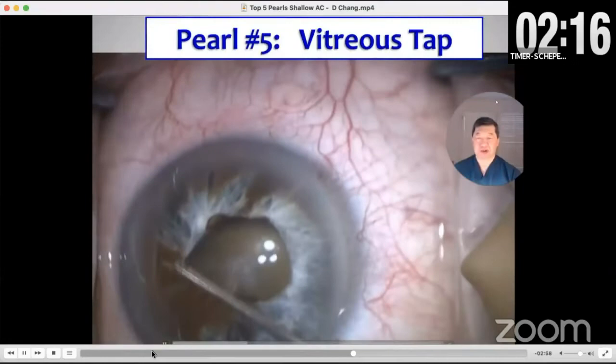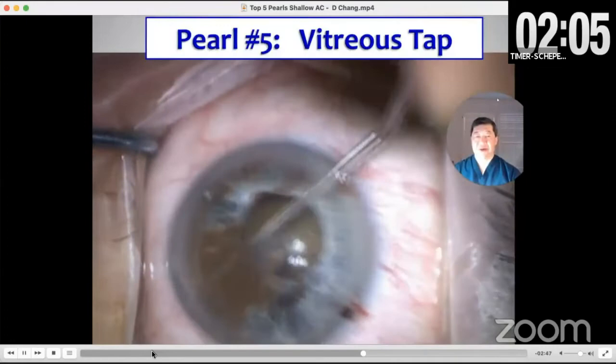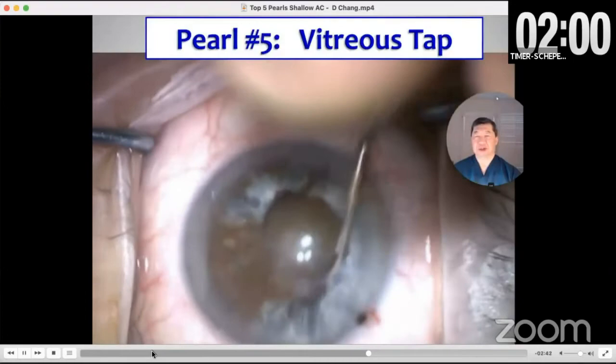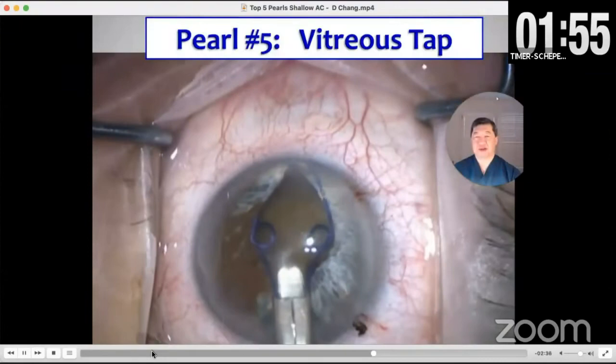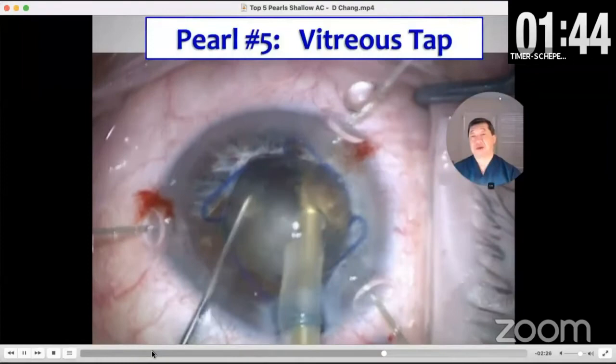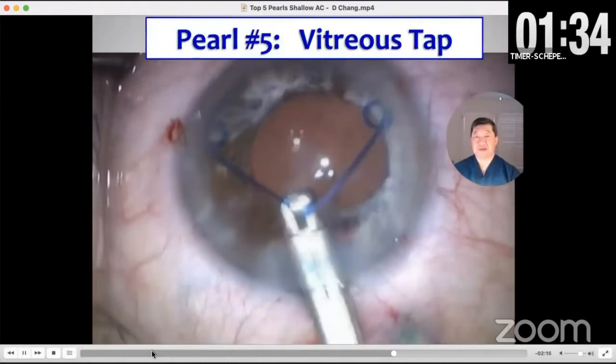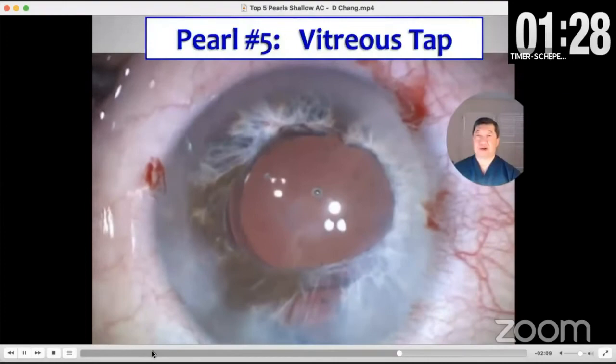I'm palpating to make sure I don't soften the globe too much. I just want to soften enough so I can fit in some more dispersive viscoelastic. These eyes not only have posterior synechiae, but the iris stroma is really stuck to the lens because the lens being pushed forward creates much greater contact with the mid-iris stroma. Now you have to deal with the small pupil — here's a Malyugin ring. I put in some dye and I like doing FACO chop in these cases to reduce ultrasound energy. You can see the case at the end, closing with an interrupted absorbable suture for the pars plana sclerotomy.